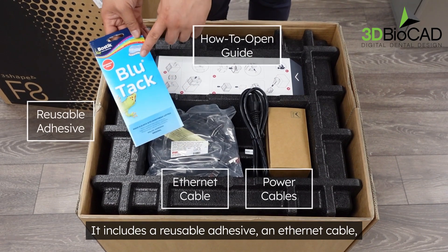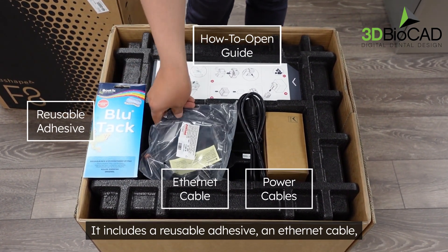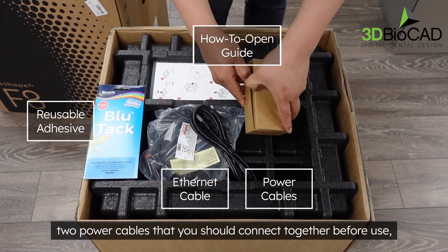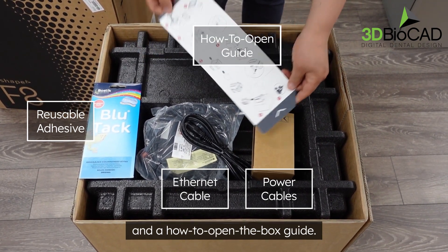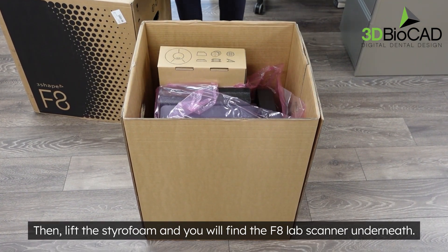It includes a reusable adhesive, an ethernet cable, and two power cables that you should connect together before use. There is also a how-to-open-the-box guide. Lift the styrofoam and you will find the F8 lab scanner underneath.